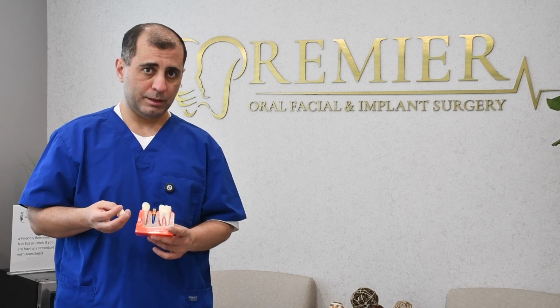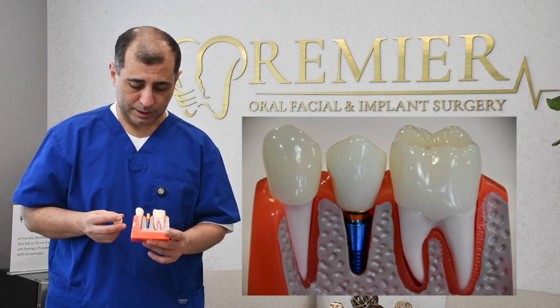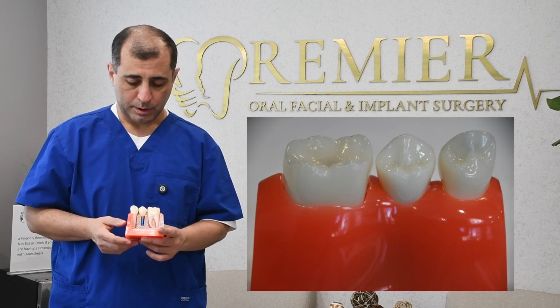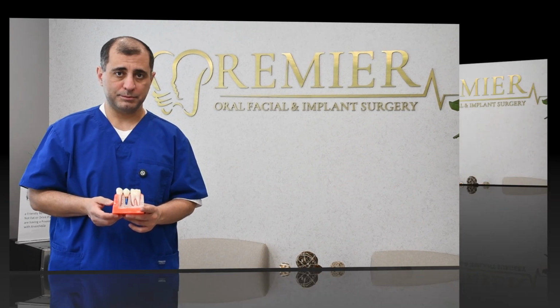After you go back to your dentist, they will start working on getting some impressions of that area and fabricating a crown that's going to replace your missing tooth in this manner.